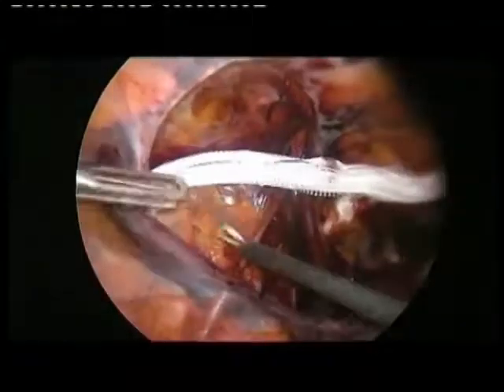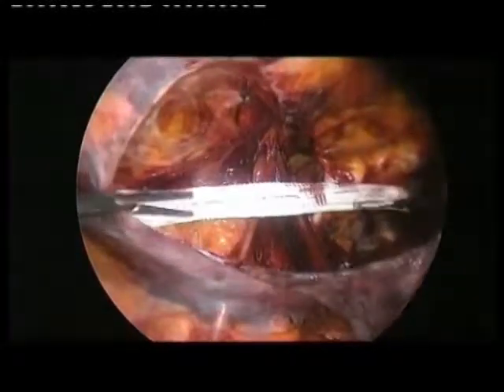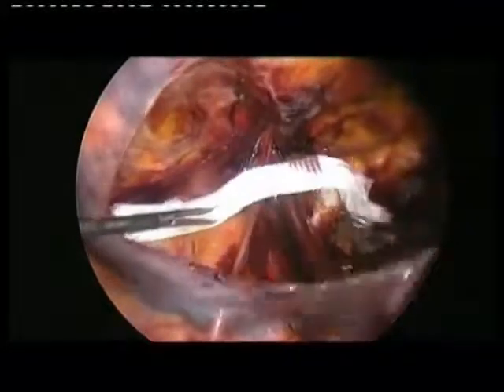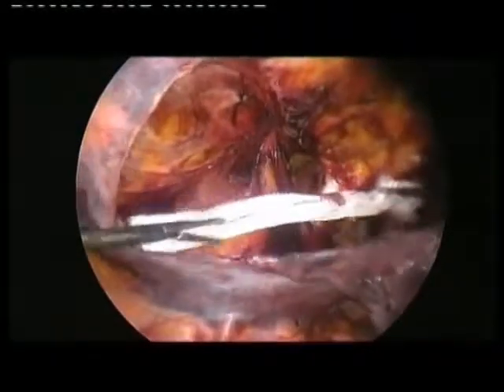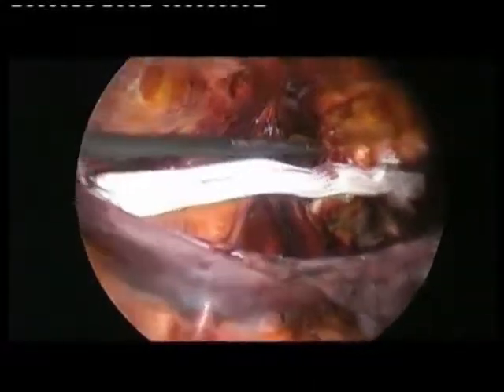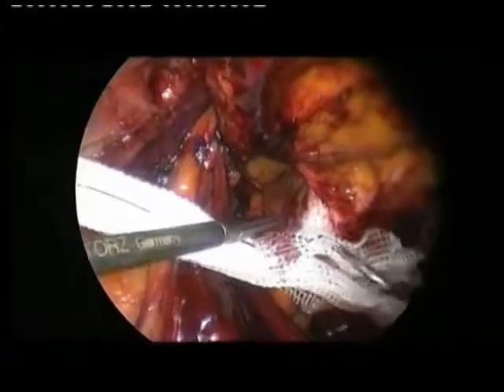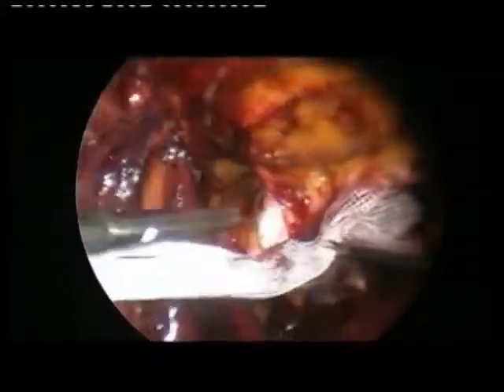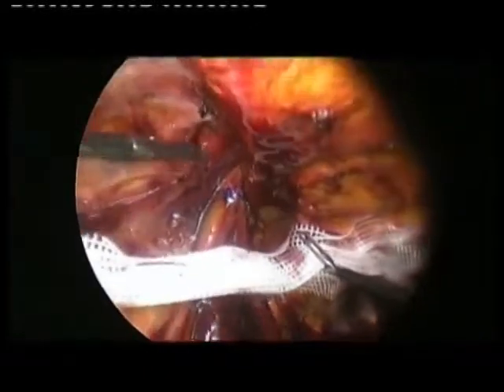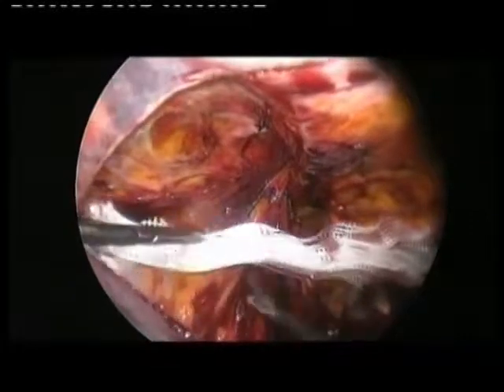So do you have the inside image? Yes. Okay, so let's see how comfortable this mesh procedure is. The mesh should be positioned in the right way, in the right position. You see, this is the medial border of the crural defect, so I have to be 2-3 centimeters medially, okay? And let's see, the lateral aspect of the other defect is here. So this is the right position.